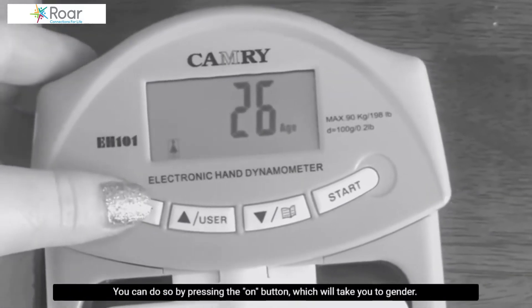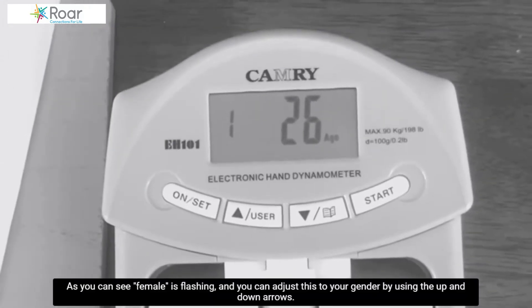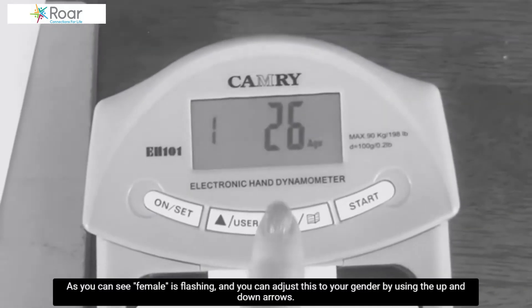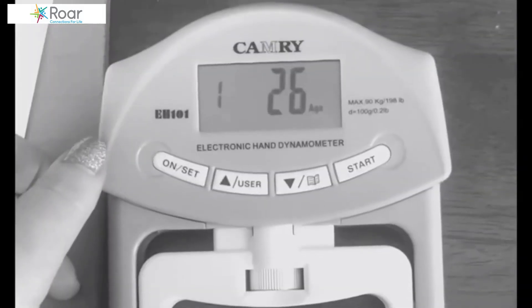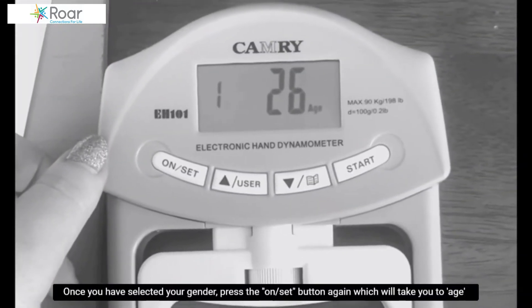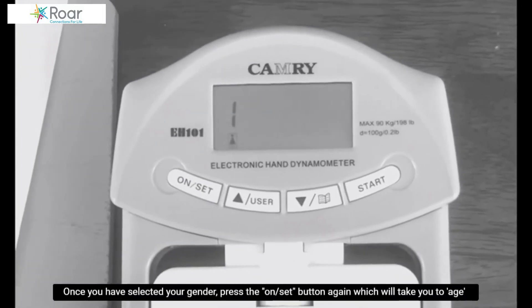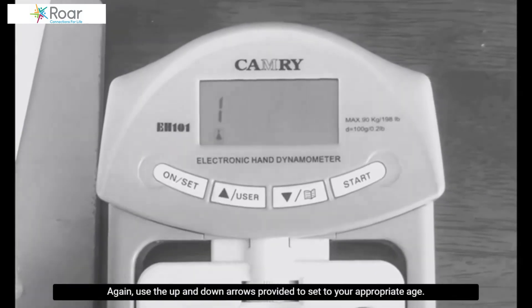You can do so by pressing the ON button, which will take you to gender. As you can see, female is flashing and you can adjust this to your gender by using the up and down arrows. Once you have selected your gender, press the ON set button again which will take you to the age. Use the up and down arrows provided to set to your appropriate age.